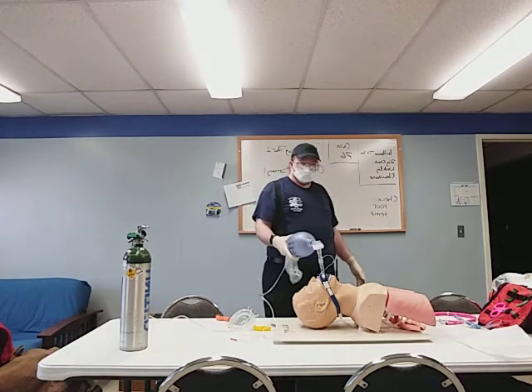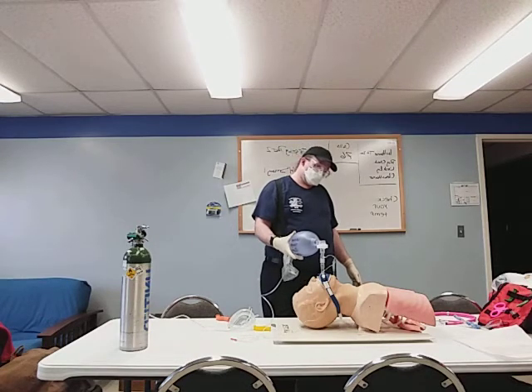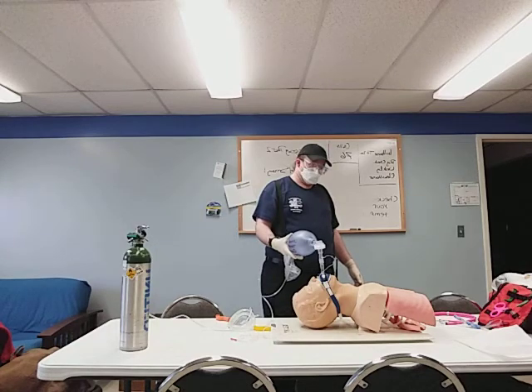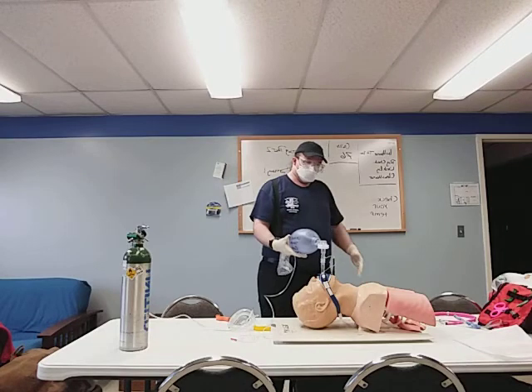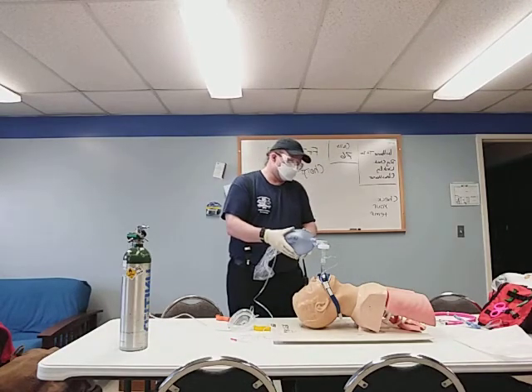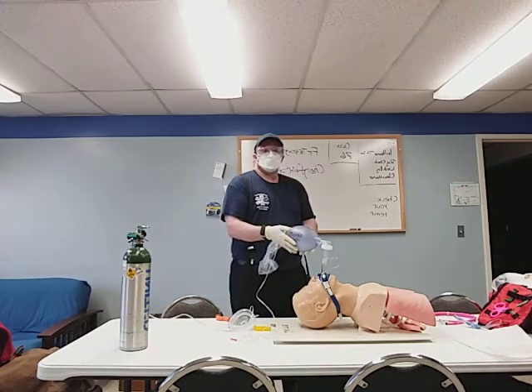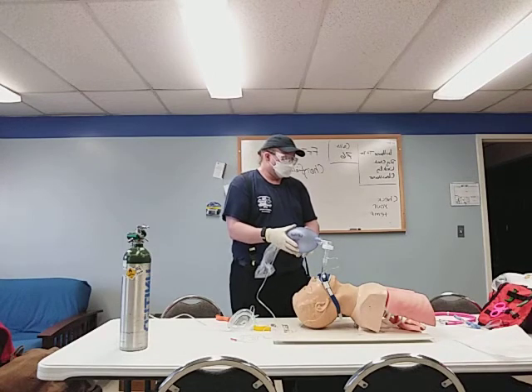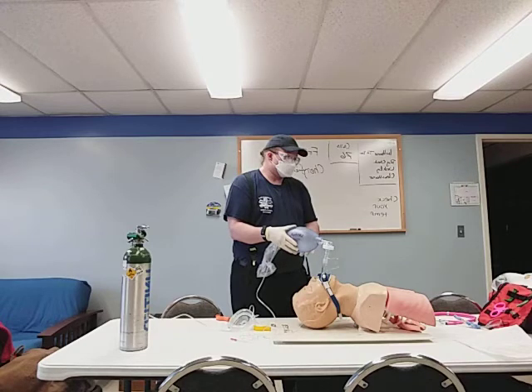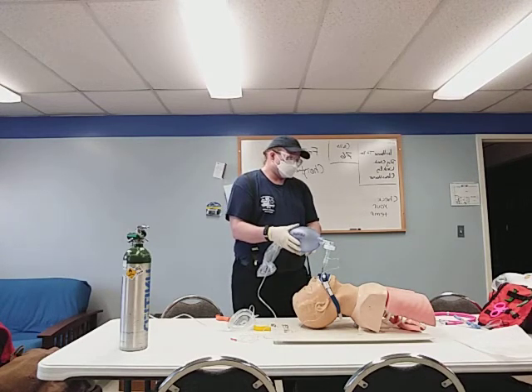And now I will monitor capnography and pulse oximetry to ensure that we're properly ventilating and getting a therapeutic effect. And I'll definitely pay attention to the rate on the monitor too. It'll help me keep from hypo or hyperventilating. 3 one-thousand, 4 one-thousand, 5 one-thousand. Lots of good chest rise.